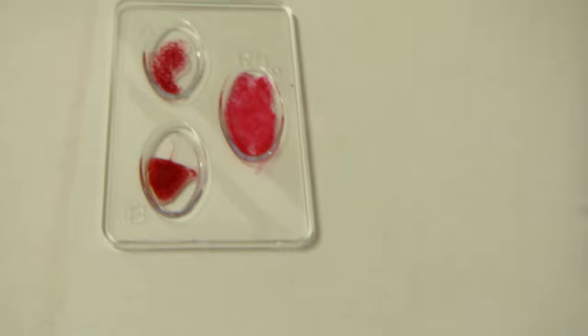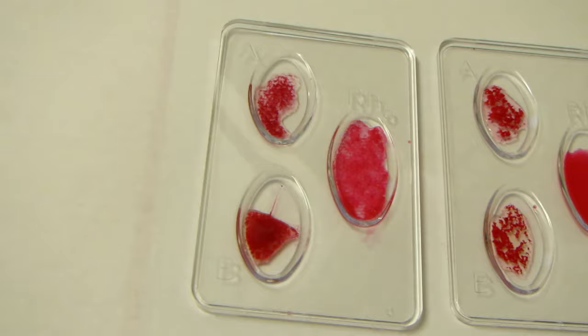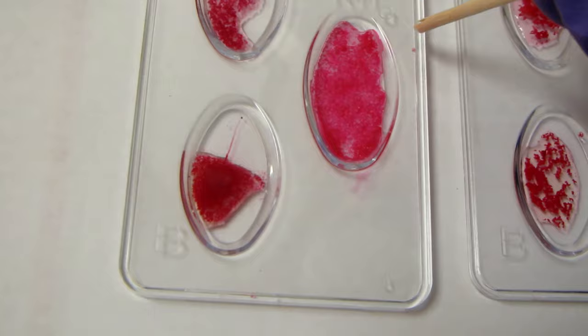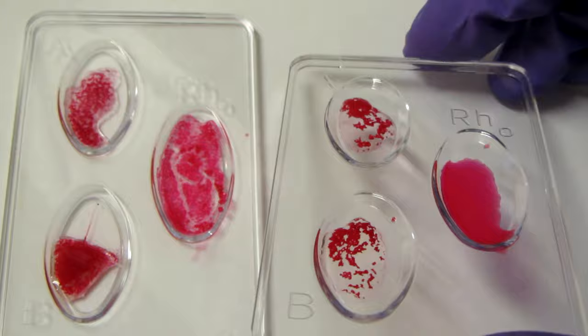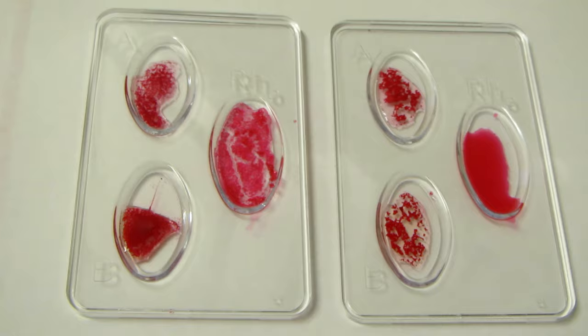Now let's compare these two: the one on the left is AB positive because we have clumping in both the A and B wells — it's pretty extensive. On the other side we have type AB negative, so we have clumping in the A and clumping in the B, but look how runny the RH is. That is type AB negative.